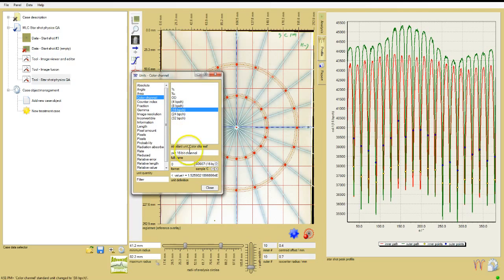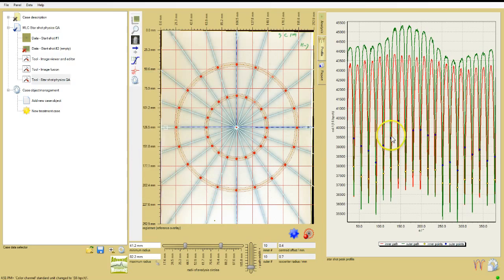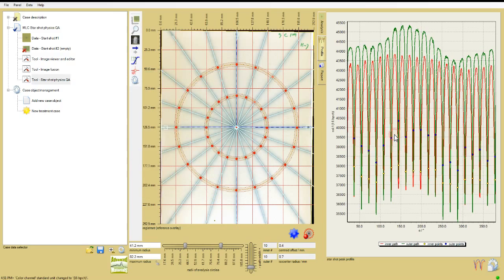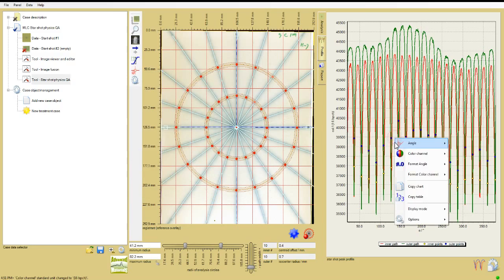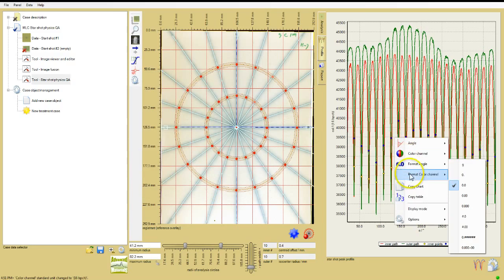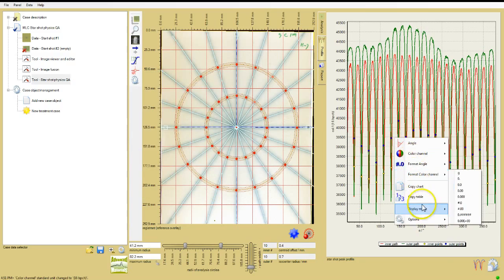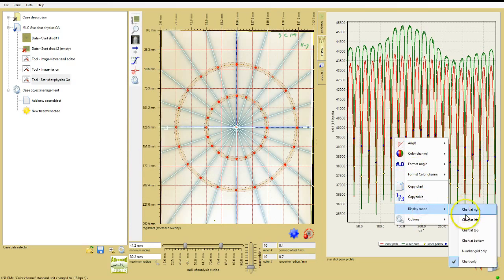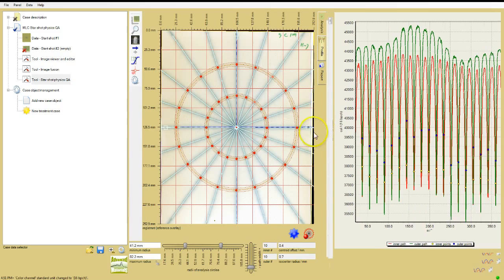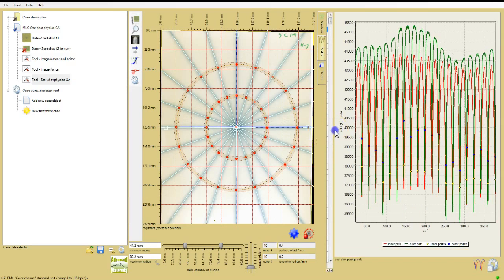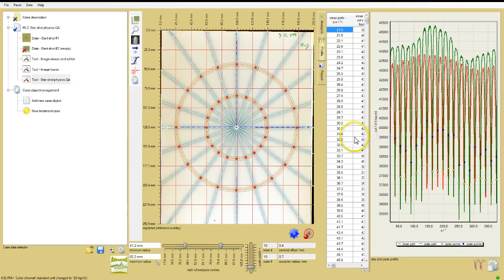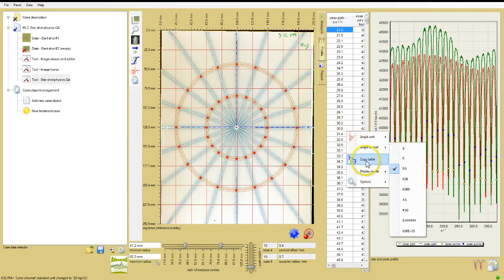Right-click in the chart area and under display mode, select one of the options to display a table of profile response values. Grab the border of the frame and slide it to display the table more fully. You can right-click on the chart or the table to copy either to another application.